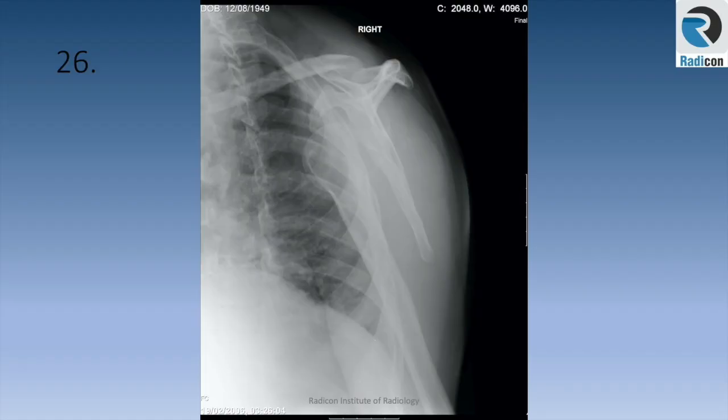Let's complete the upper limb review with looking at some shoulder cases for rapid reporting.